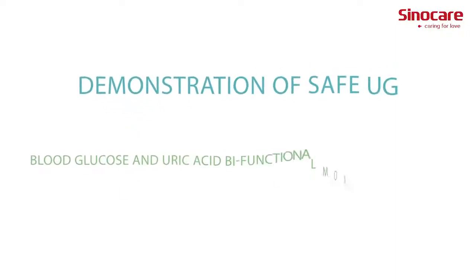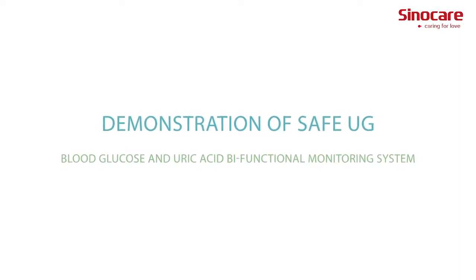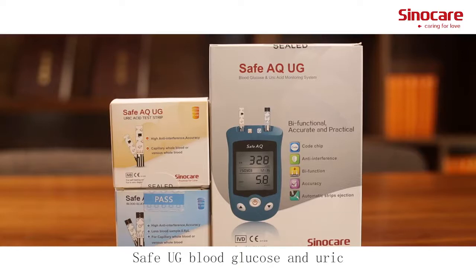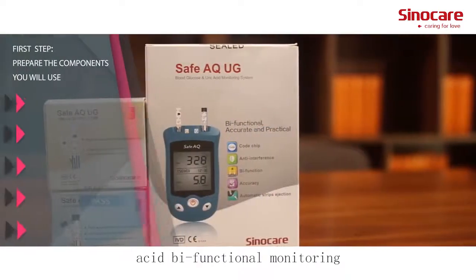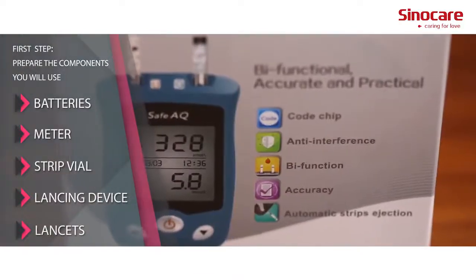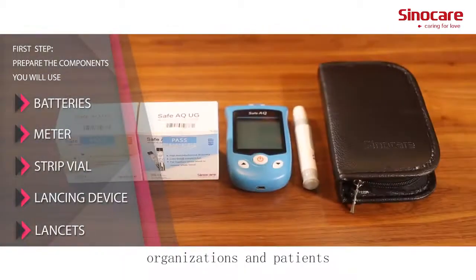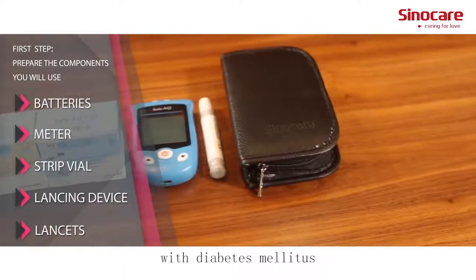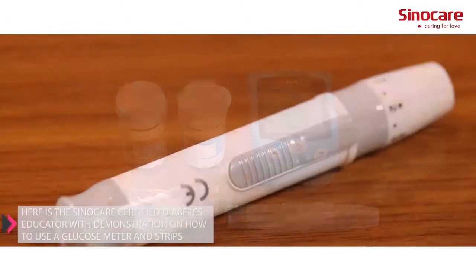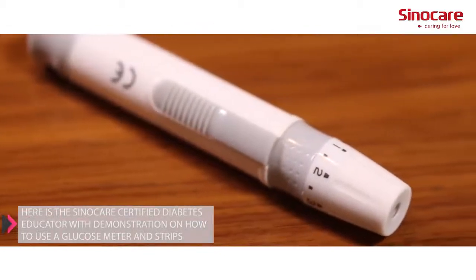Demonstration of the SAFE UG Blood Glucose and Uric Acid Bifunctional Monitoring System. This system is easy to operate — one drop of blood, two indexes tested. It can be applied to medical organizations and patients with diabetes. Here is the SinoCare Certified Diabetes Educator with a demonstration on how to use the glucose meter and strips.